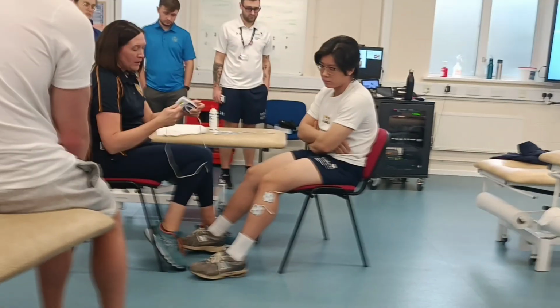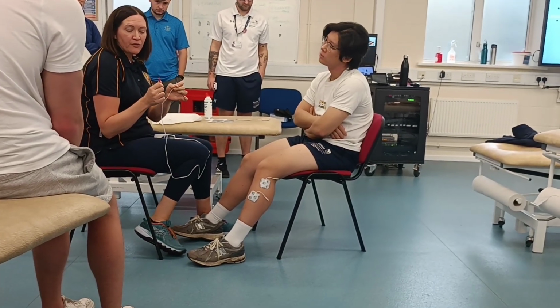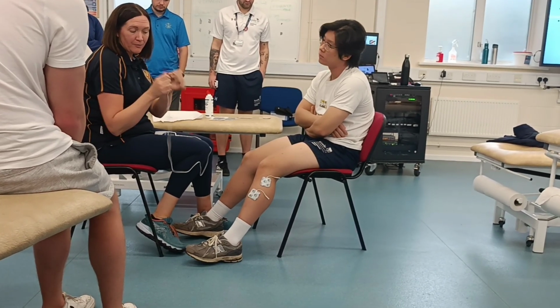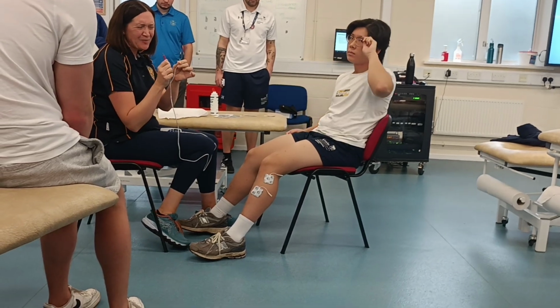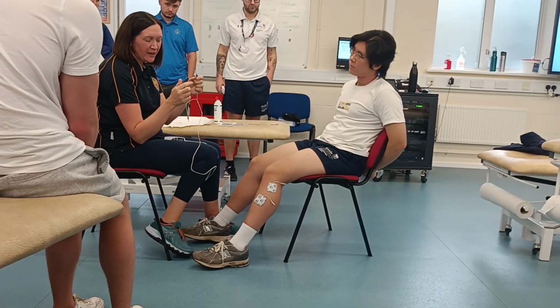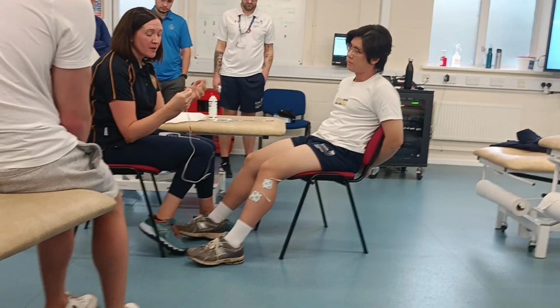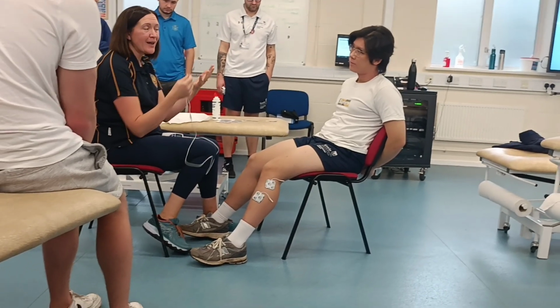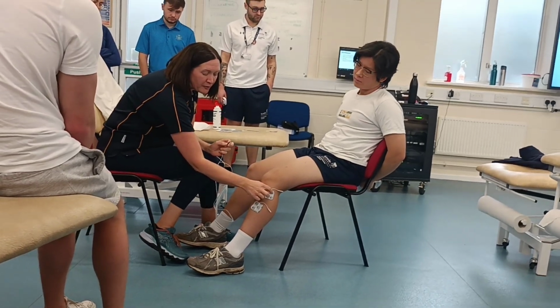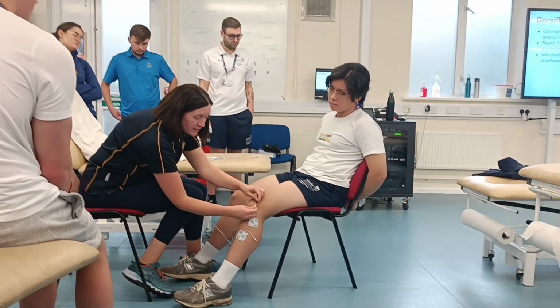Okay. I said earlier that these machines are symmetrical, so the current goes through both of the ends in the same distribution, but generally when you're out on placement, the other devices will be asymmetrical, so that most of the current goes through the active, the black electrode. So I always put the black one to the head, because it's the more active one. You want to stimulate the common peroneal nerve more than you do the muscle belly. Okay, generally. So that active one's going on the top.